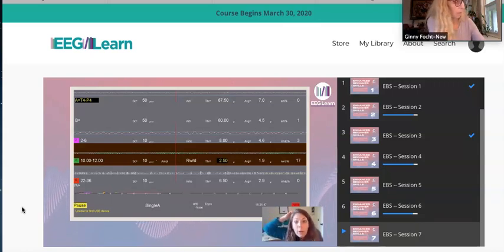There should be a fair amount of alpha activity showing up at P4, right? And so if we're looking at the difference in the alpha activity at T4 versus P4 and we're getting a really low number, chances are they don't have very much alpha at P4. We're going to try to encourage their brain to learn how to make more alpha at P4. P is in Paul. P4 where it belongs.